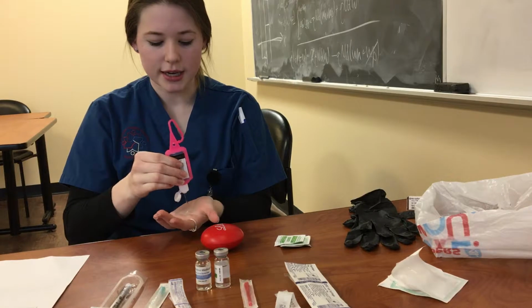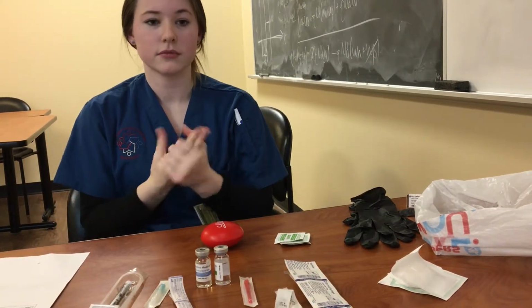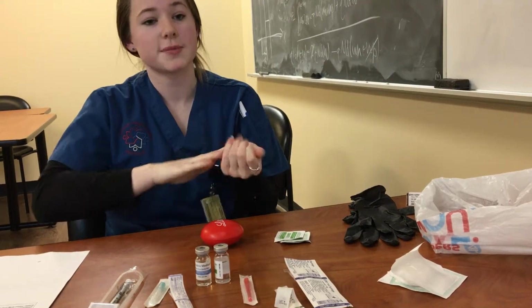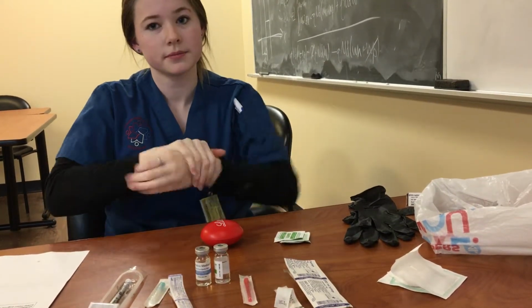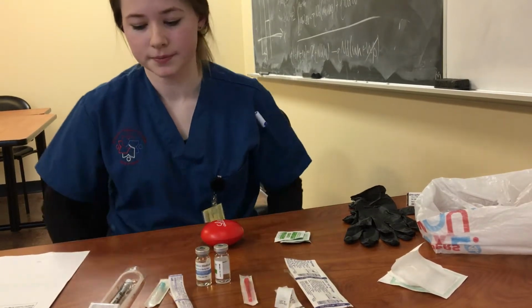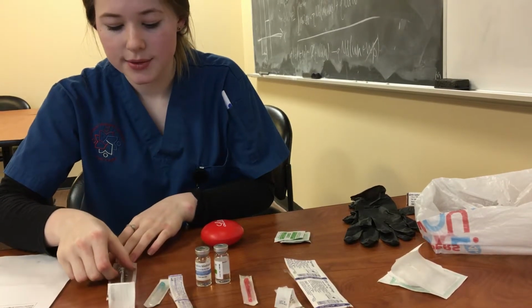So I'm going to perform hand hygiene, and assemble my supplies before I bring it to the patient. So I'm going to open my subcutaneous syringe.